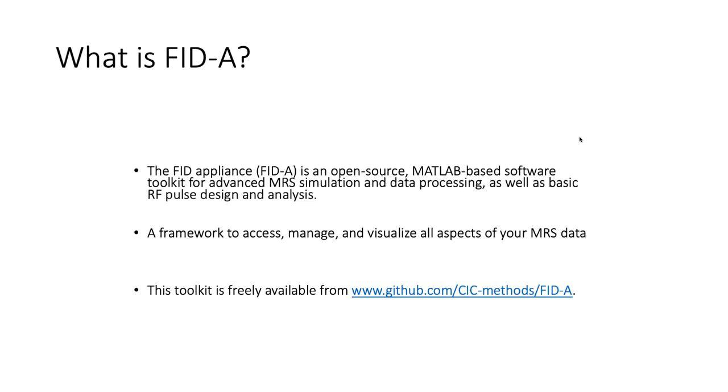So first, what is FID-A? Well, FID-A is an open source Matlab-based software toolkit for MR spectroscopy simulation, data processing, as well as RF pulse design and analysis. FID-A gives us a framework to access, manage, and visualize all aspects of your MRS data. The source code is fully open and it's accessible on GitHub at the website URL shown here.